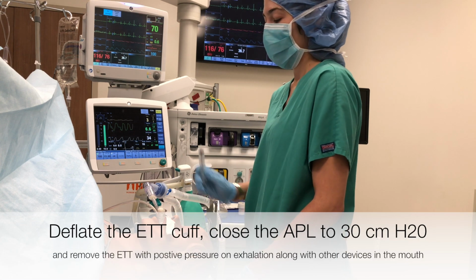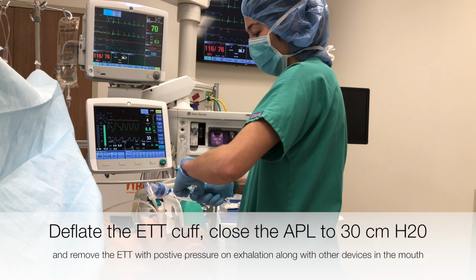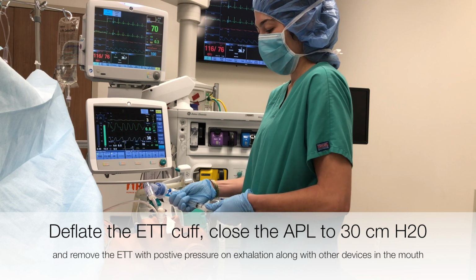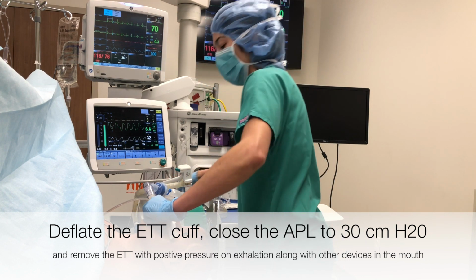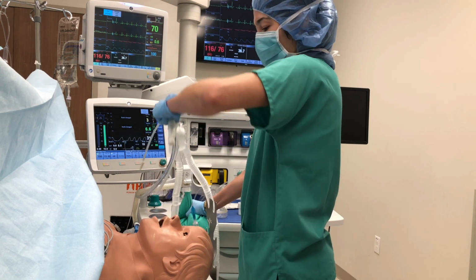Deflate the cuff. Close the APL valve to 30, and on expiration, pull the tube along with the bite block, temp probe, and OG if one is placed.